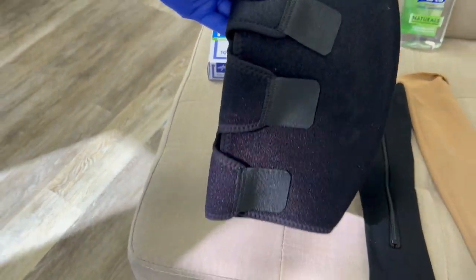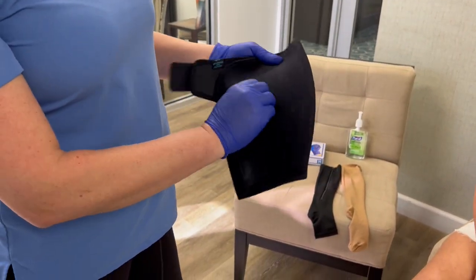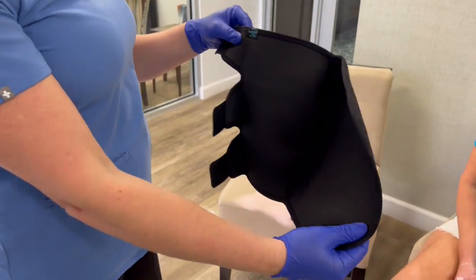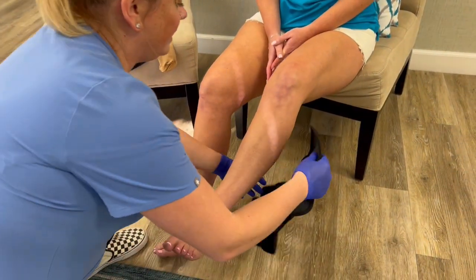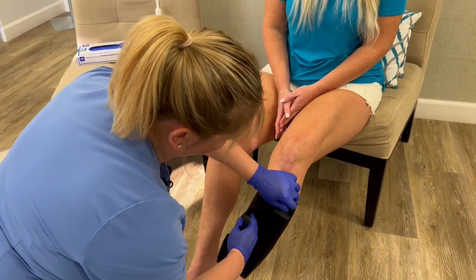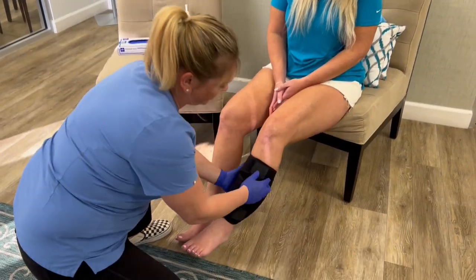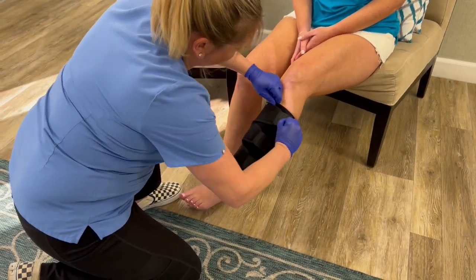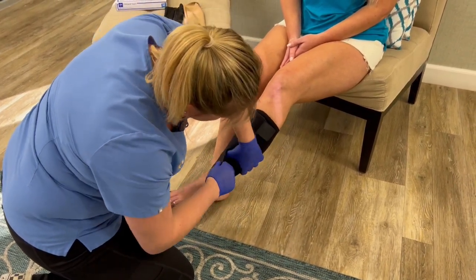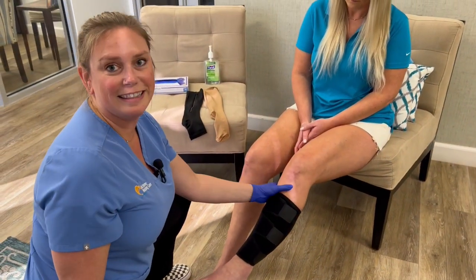Finally, I'm going to show you a Velcro compression. This one doesn't have toes, so it is a little bit different. We're going to open it up and wrap it around the leg. Gently peel off the Velcro, pull it across, and then get it tighter and really pull that. You can repeat that as many times as you need to get the desired level of compression. This is obviously the easiest one to apply.